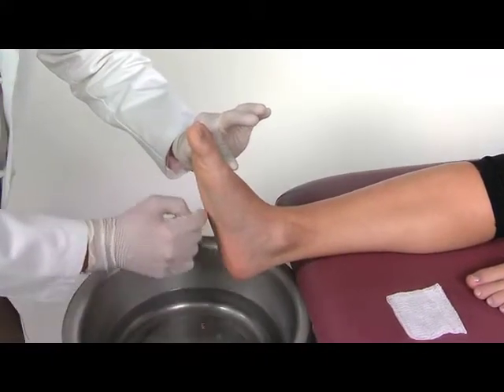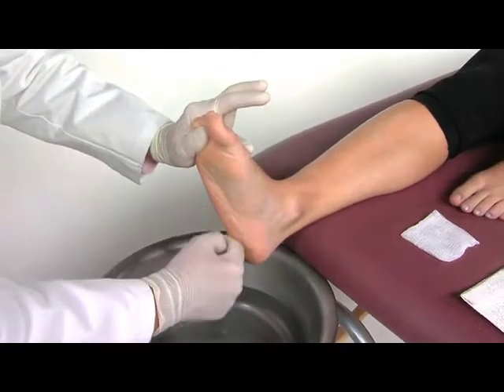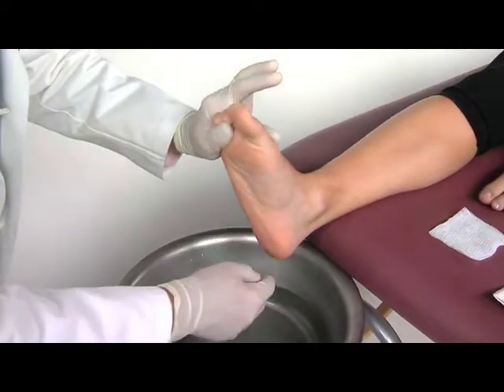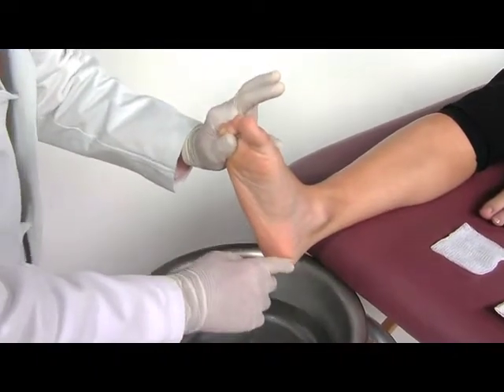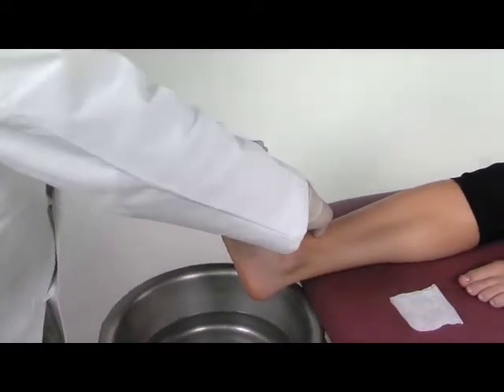The lateral arch is a little bit present — not too much — we can see a little bit right here, but again loading the lateral part and pulling up on the fifth, fourth, and third toes just like this.